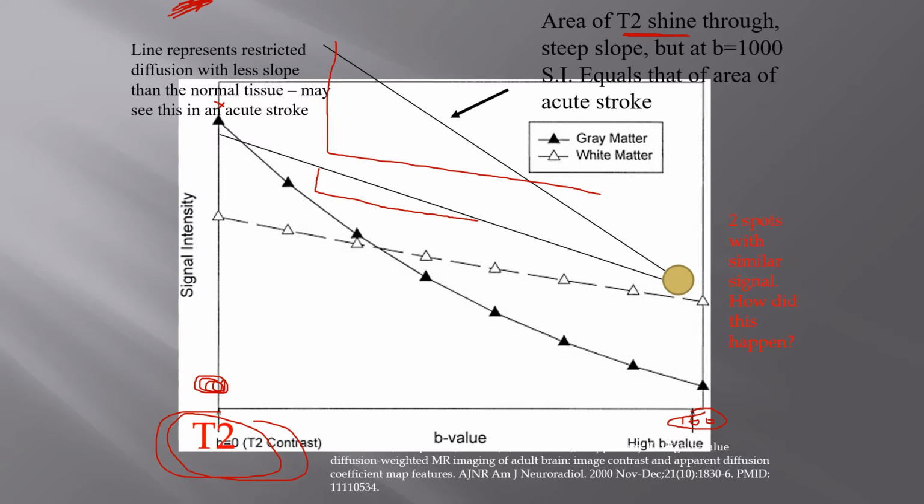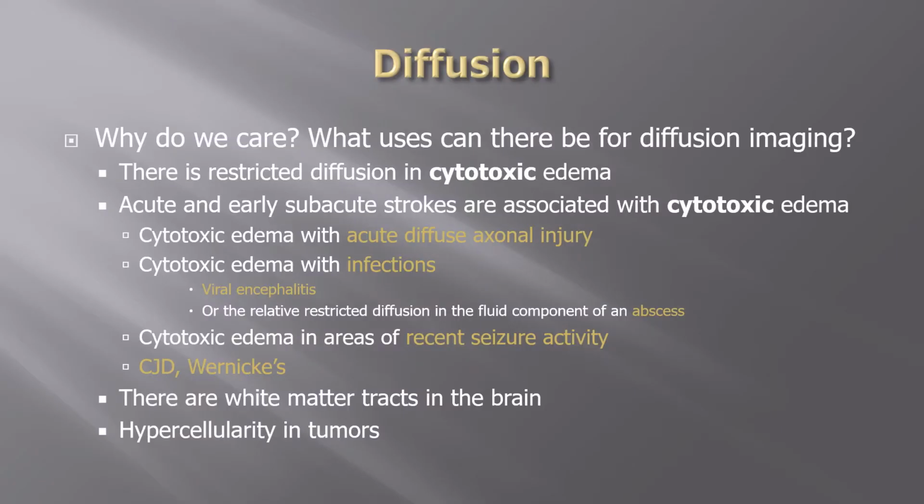And this might be an area of demyelination, which predominantly have elevated diffusion and lots of T2 signal. And a number of times, demyelinating lesions do have T2 shine through, but then on the ADC, they actually have elevated values, not restricted values. So that's why we care.